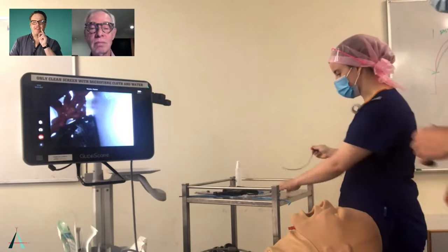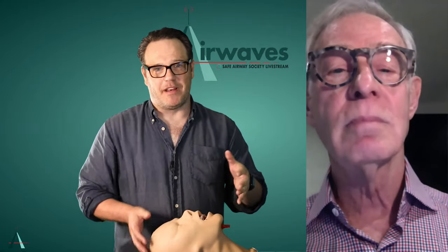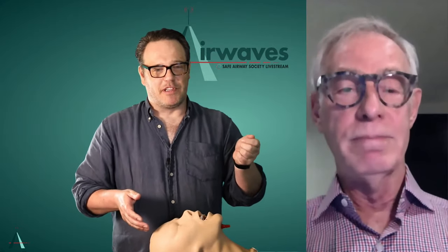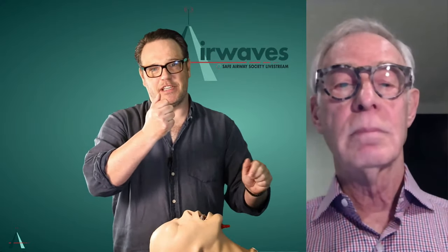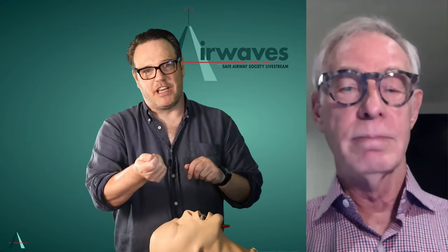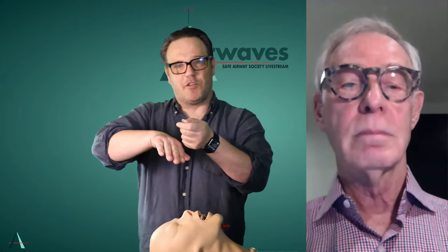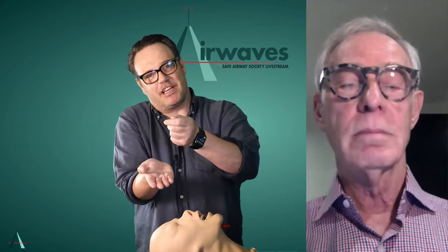So just while I remember, Richard, there are three issues I wanted to talk about. One relates to position. We were talking about sniffing position or flexion-extension versus neutral. We've talked a little bit about shuffling the stylet out of the tube to get it to feed. The other thing is the idea of rightwards rotation. So when we're doing direct laryngoscopy and you get hang-up above the cords, we tend to rotate anti-clockwise to get the bevel to clear at the back. But if you're getting hang-up below the cords with the hyperangulated blade, you're really wanting to do the opposite, aren't you? Get that bevel to clear at the front and rotate to the right.